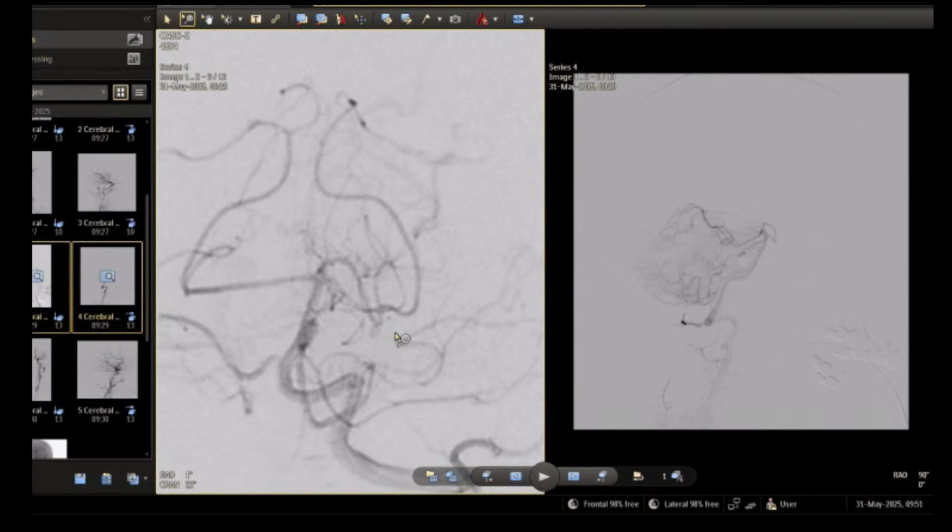Yeah, okay, there is no problem. Abzal gave 80% of contrast. Then it's more concentrated, and deflation time is longer. It's not a problem. Okay, now we can see the projection was chosen by Abzal.